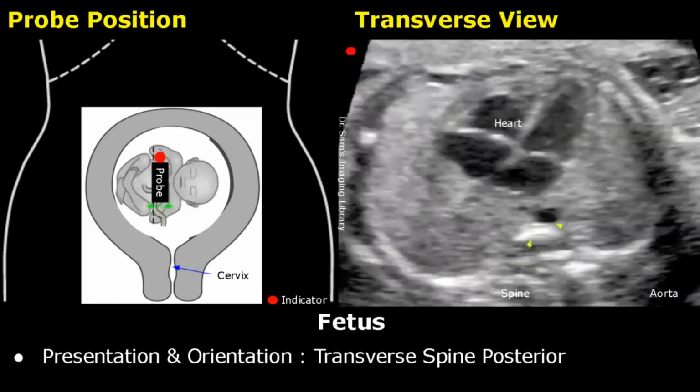In this type of transverse presentation, the fetal head is towards the left side and facing the anterior aspect of the uterus. This is an image of the heart. It will be found at this side. The stomach will also be found at this side.